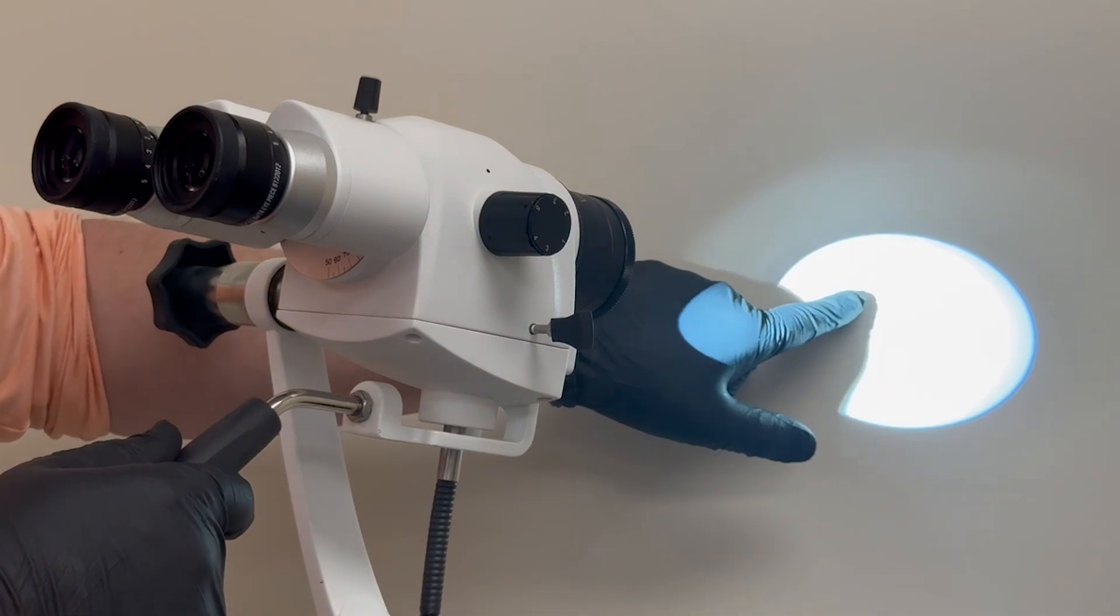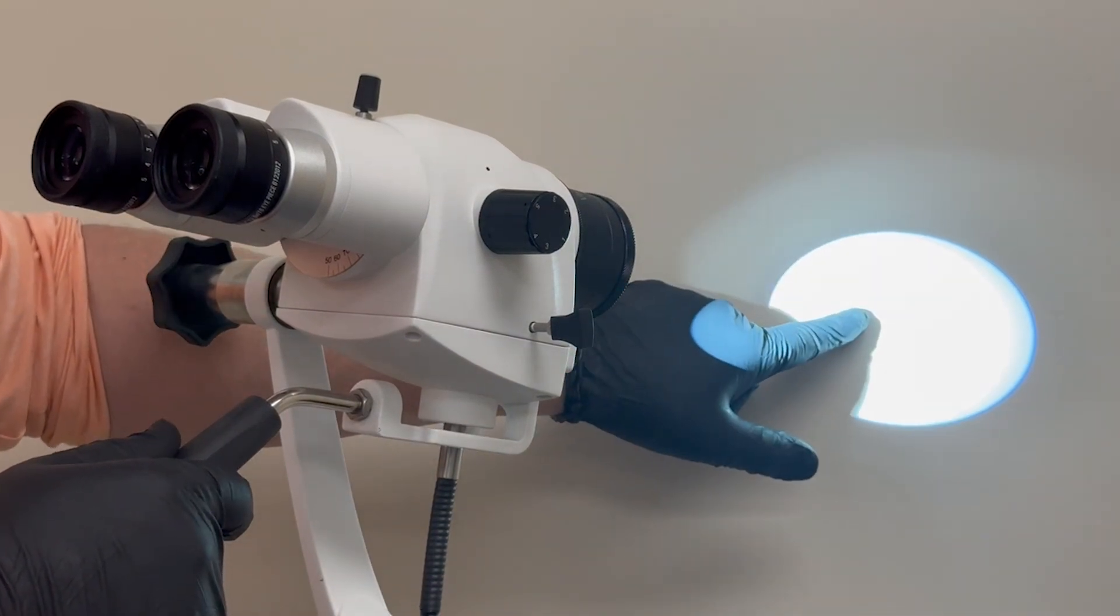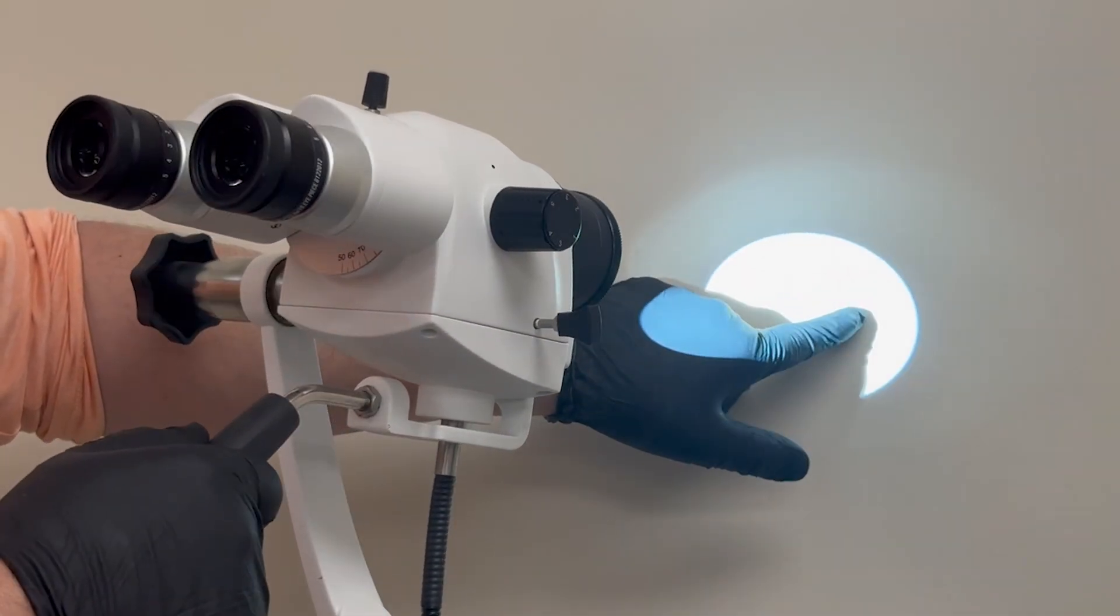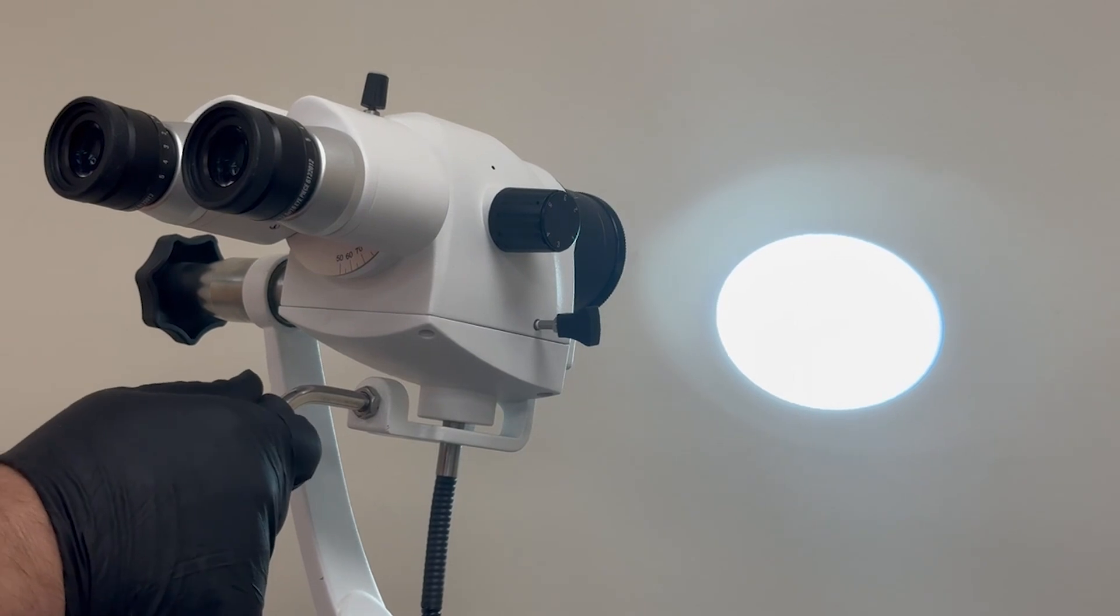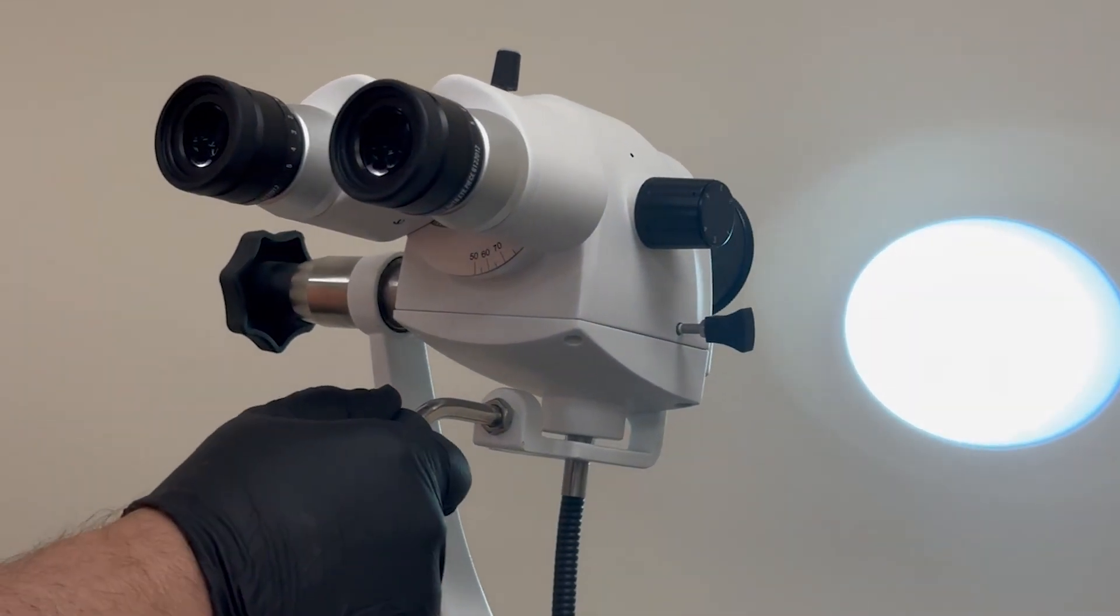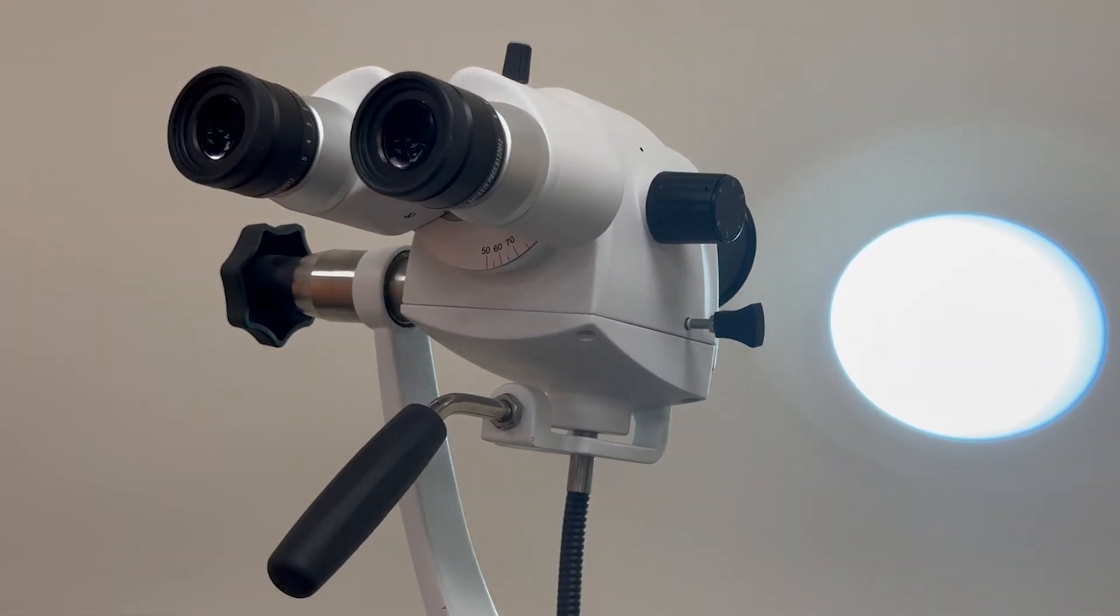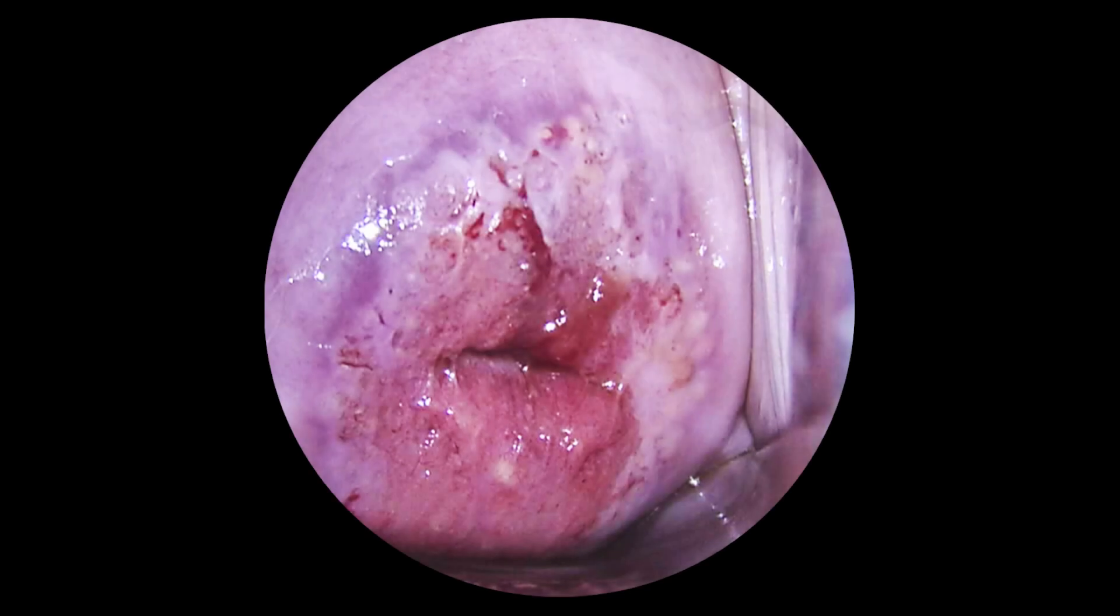The key advantage of coaxial illumination is its ability to produce a shadow-free viewing experience, coupled with unparalleled light quality. This means that medical professionals can observe tissues and structures without the interference of shadows, allowing for more accurate examinations and diagnoses.